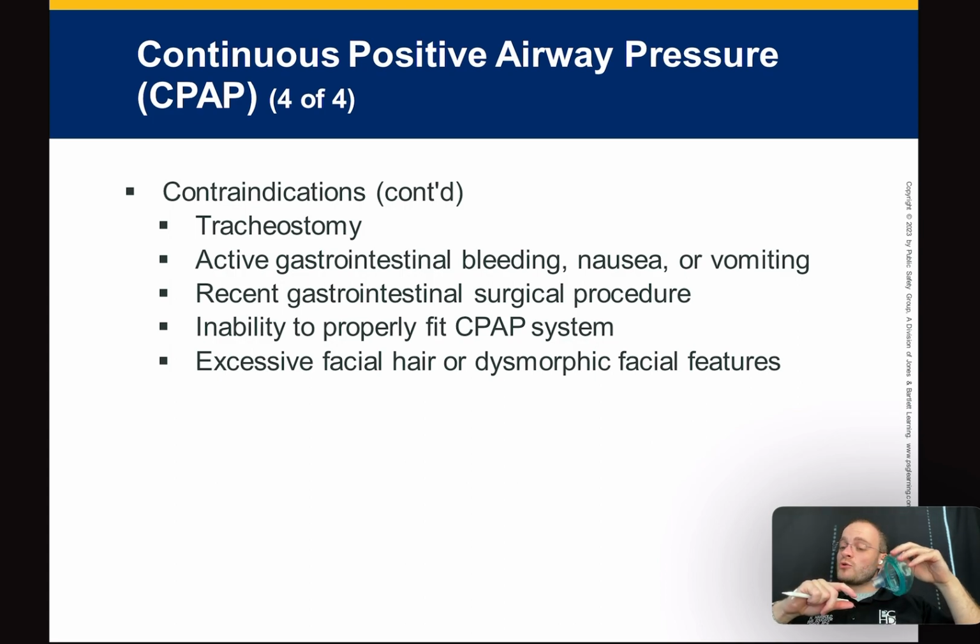Excessive facial hair or dysmorphic faces, right? If they have messed up facial features, right? Really small jaw or something like a big old biker beard or something like that, right? You can't use this.